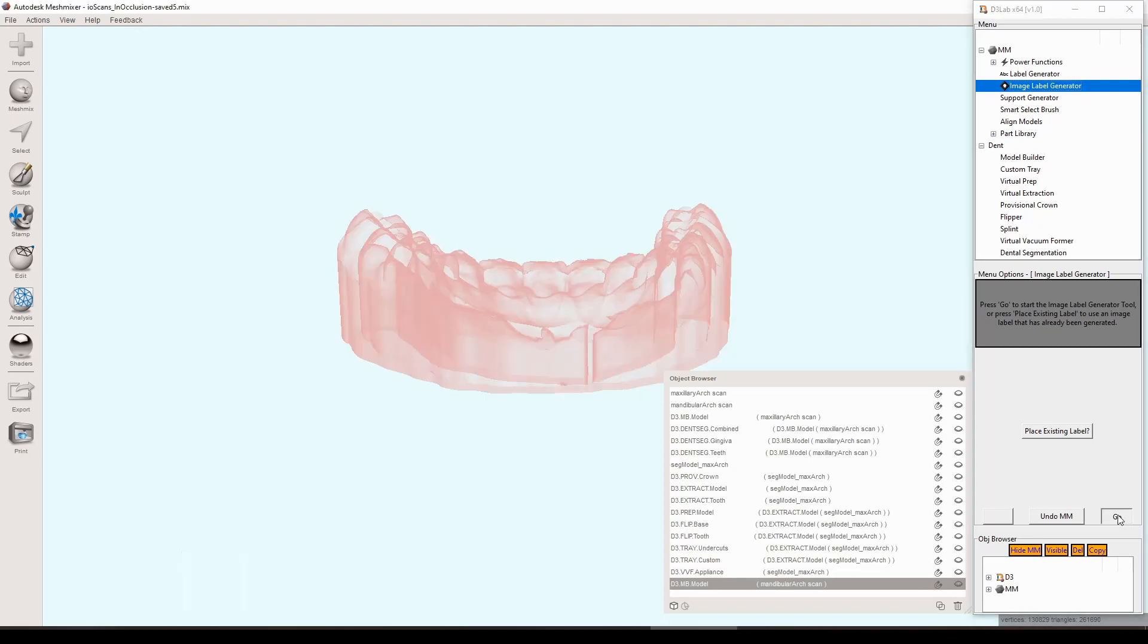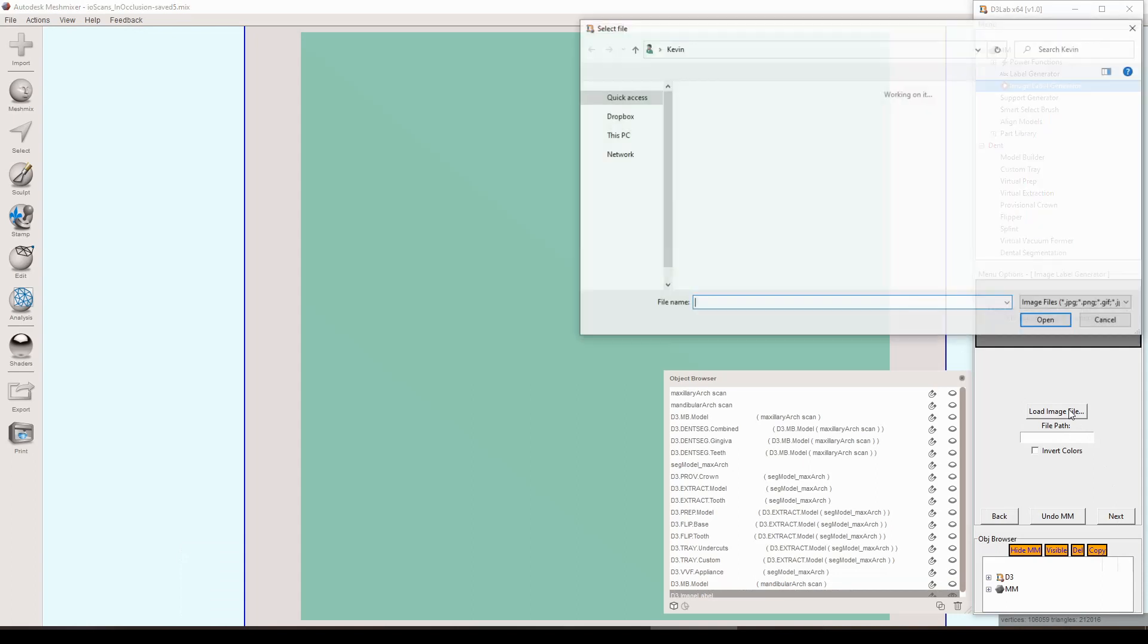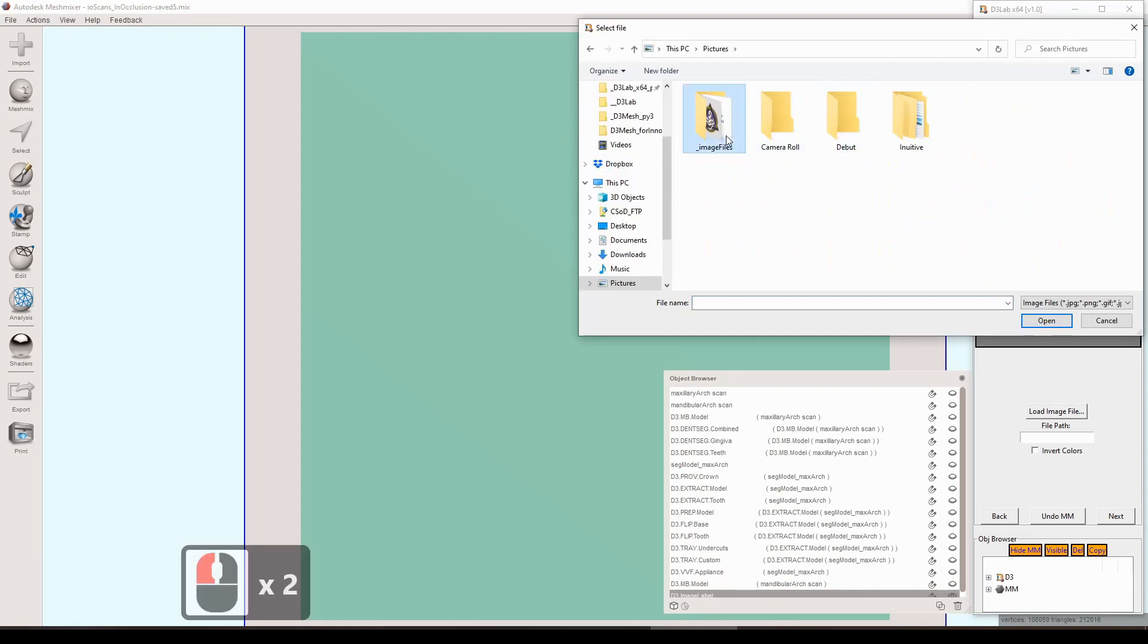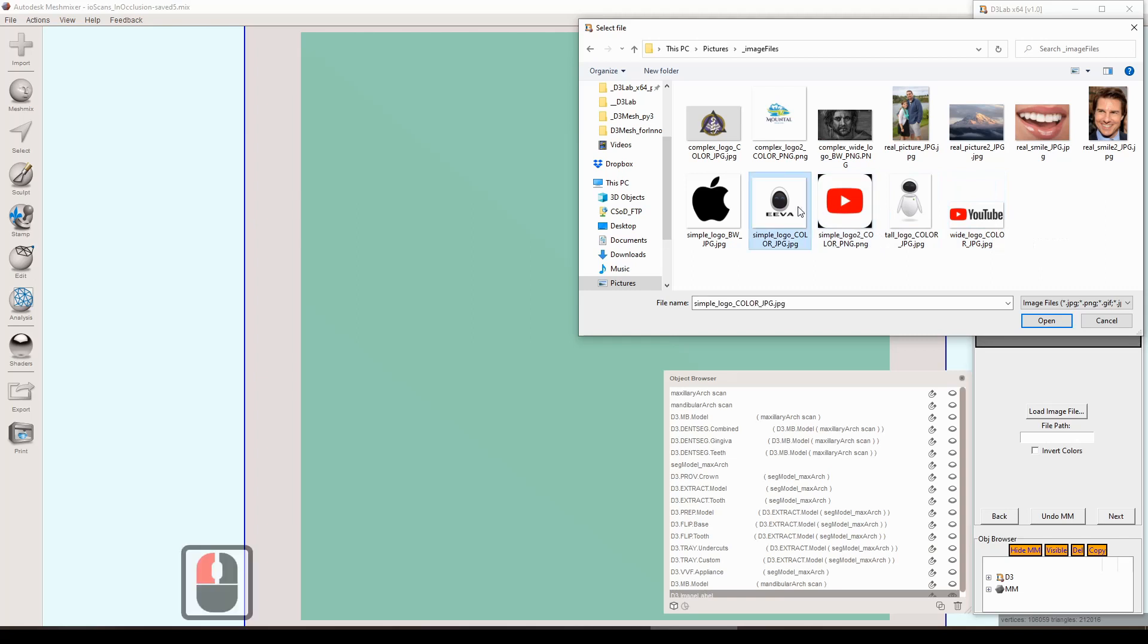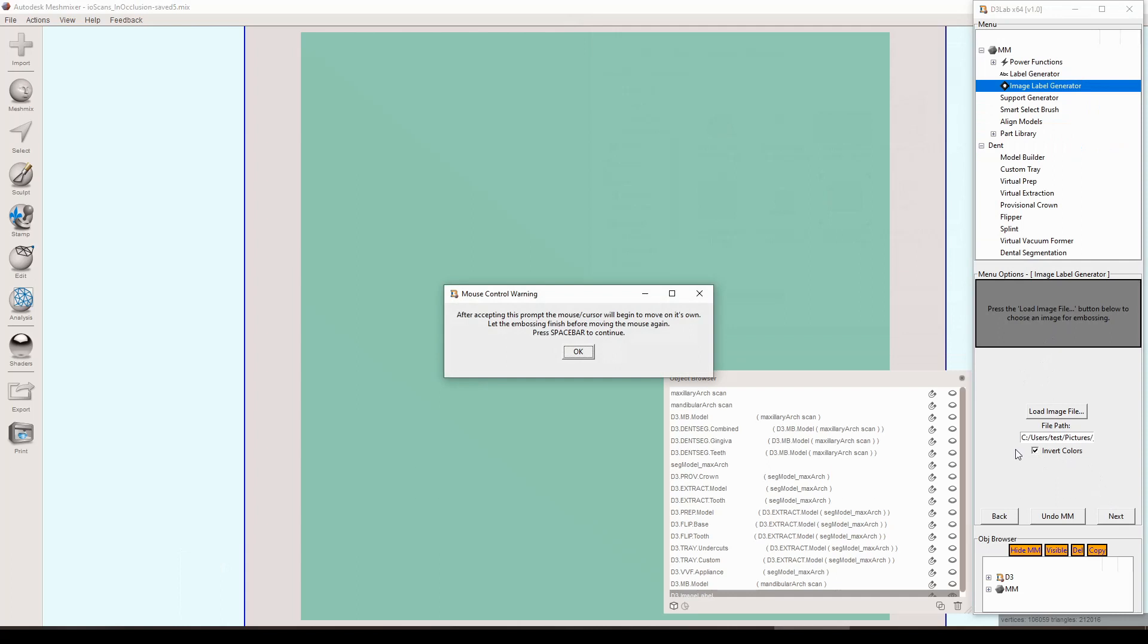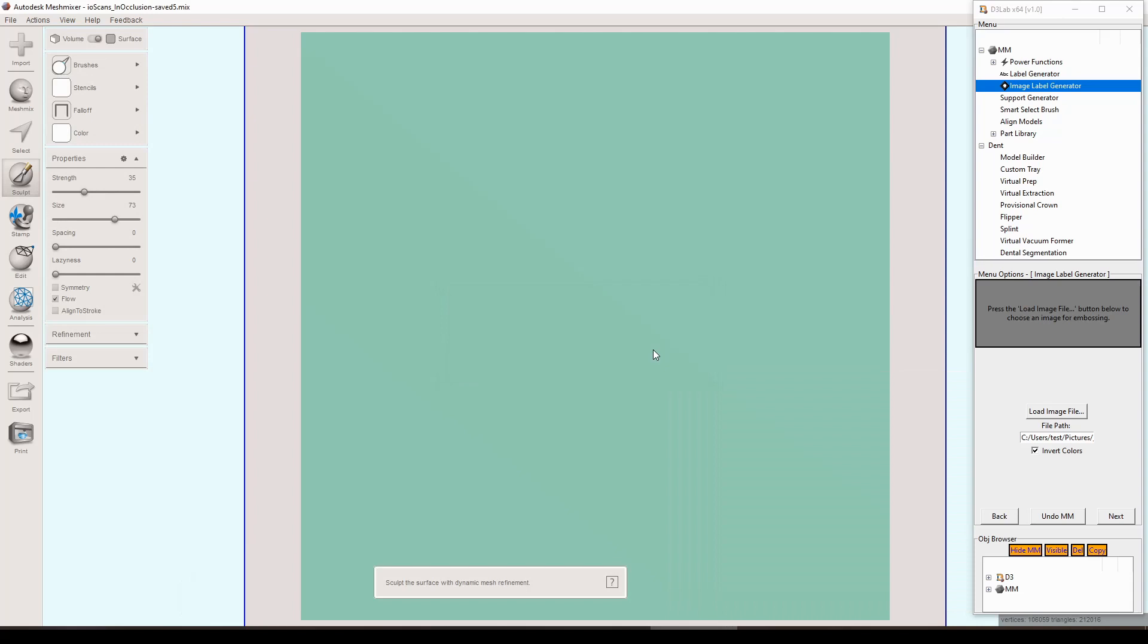Generally speaking it works with almost any image that you give it because I try to normalize each image that comes in. Getting back to the tool itself, you start by clicking on the tool name in the uppermost part of the d3 lab tool menu. You're always presented the option of loading an existing label if you've already created one. In the case that you're creating a new one, you're given the option to load a file. I'm just going to choose this one for right now. You'll notice the background on that is white, so it makes sense to check this box that says invert colors to ensure that the background is black.